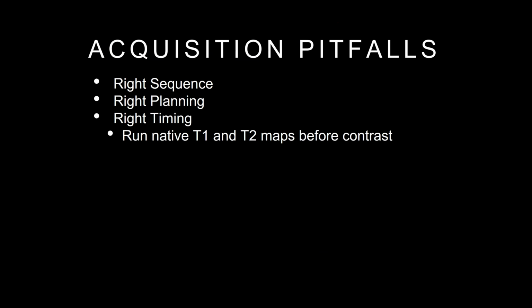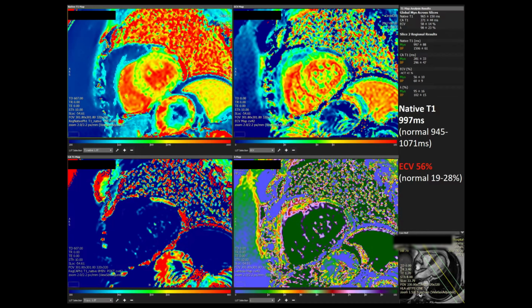Timing is important. You've got to run your native T1 and T2 maps before contrast. That seems obvious, but again, techs sometimes fall foul of this. And there is a fixed time for your post-contrast T1 maps. At our institution, it's at 15 minutes.